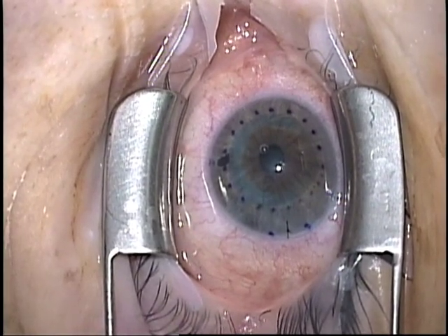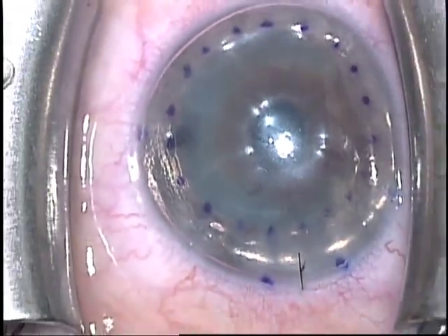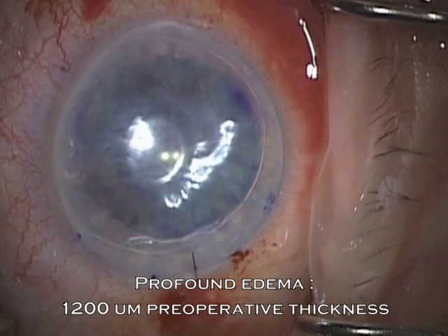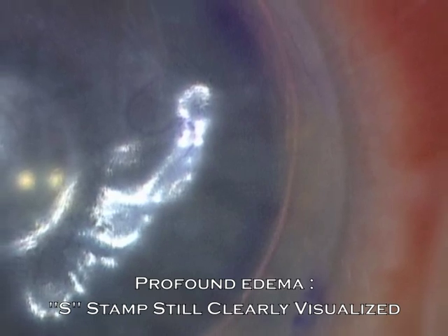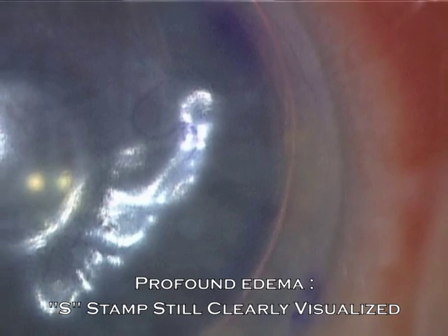There it is before lifting it into position with gas, and after the gas is in the eye, still confirming correct orientation of the graft. This technique also works in cases with profound edema, where other techniques can be more challenging. As you can see in this 1.2mm thick cornea, I could still see the S-stamp confirming correct graft orientation, even through a very edematous host.